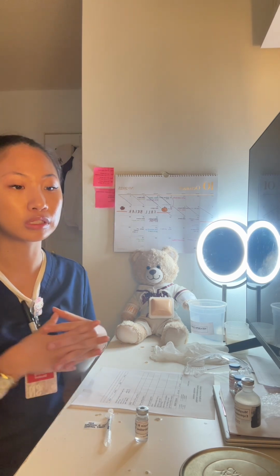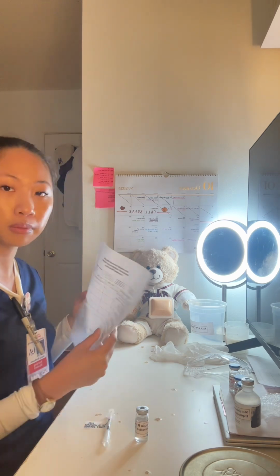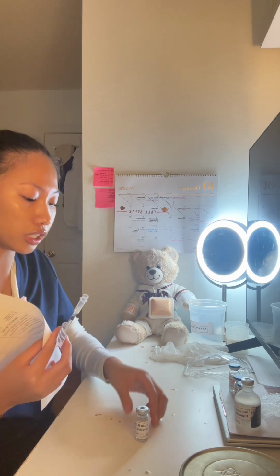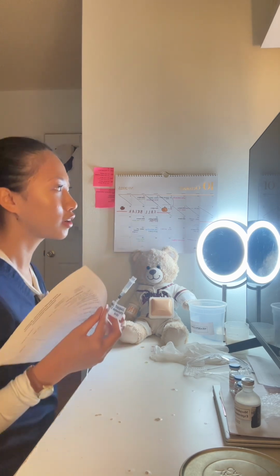So we are able to leave the storage unit and head over to Mr. Jones's room. So I'm gonna go ahead and take my MAR. I'm gonna take my insulin syringe here. I'm gonna take the insulin and head on over. So walking over, okay.